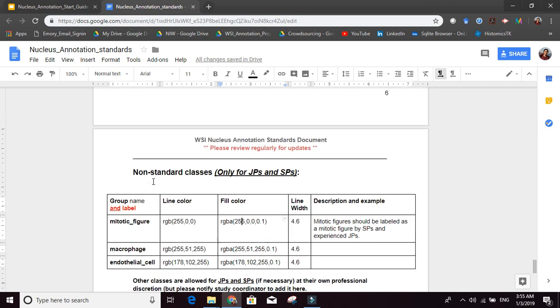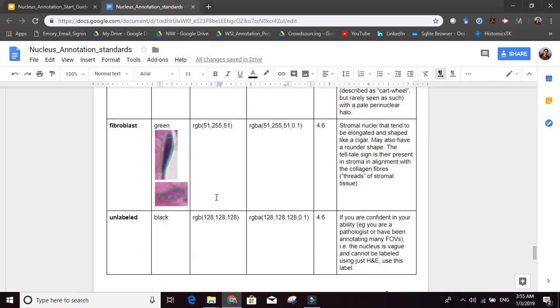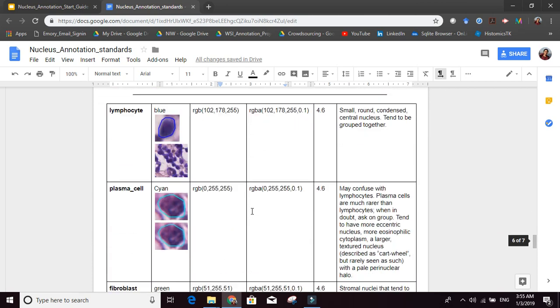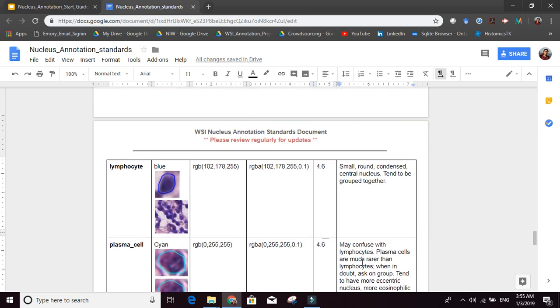So these are also things that you may want to annotate. But for the non-pathologists and actually for everyone, these are the 5 key classes. Again, tumor, lymphocyte, plasma cells, fibroblasts, and other or unlabeled or vague, whatever, right? But use the exact same words here, exact same colors, exact same line thickness as in this document, okay?